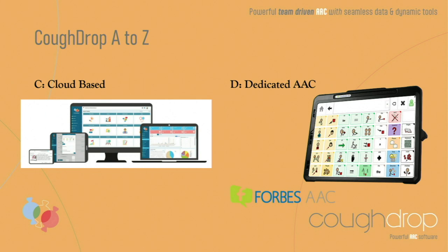Another thing is D. We have dedicated AAC systems. Again, you can tell we're partnered with Forbes AAC, so we run on all of their devices. Any of the Pro Slates, so they have the Pro Slate 8, the Pro Slate 10, the Pro Slate 13 that also has eye gaze. And then we also have the Win Slate.